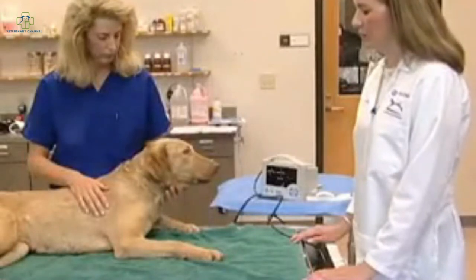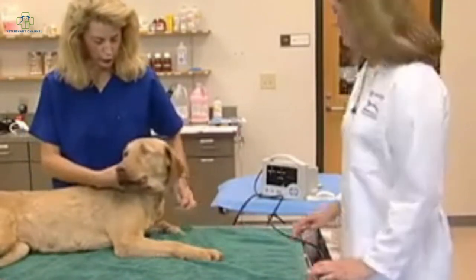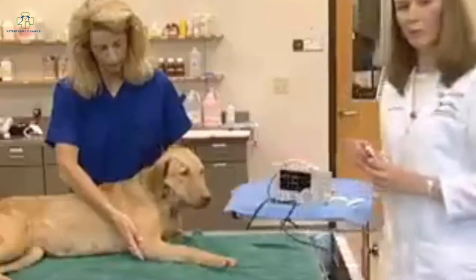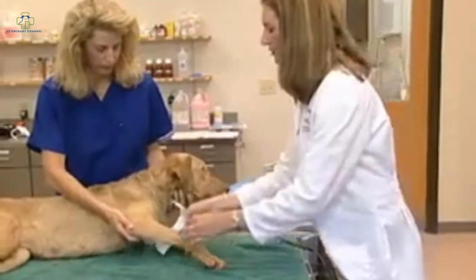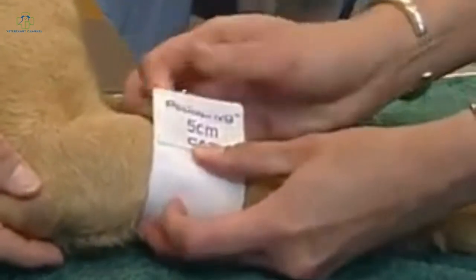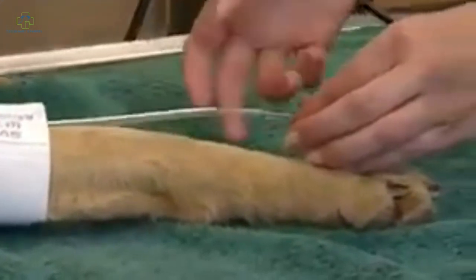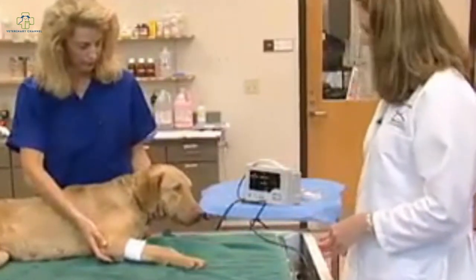In this case, we have our patient sternal, and we're going to place the cuff just below the elbow. As before, it's important to measure to determine the correct cuff size — measuring the circumference of the limb in centimeters and multiplying by 0.4. Once we've determined our cuff size, we place the cuff. It's very important to make sure the hair coat is flat; wetting the hair down with alcohol or water can be helpful. Make sure the cuff is flat with no rolls, and the tubing extends down the limb in conjunction with the direction of the artery. Once the cuff is in place, secure it with a small piece of tape.